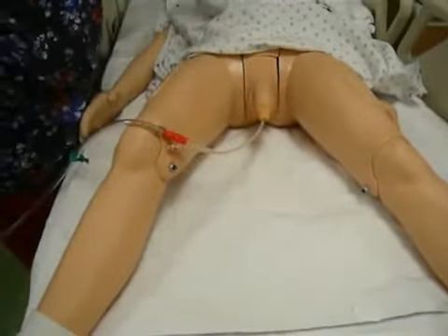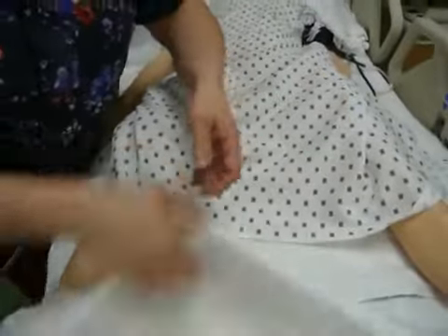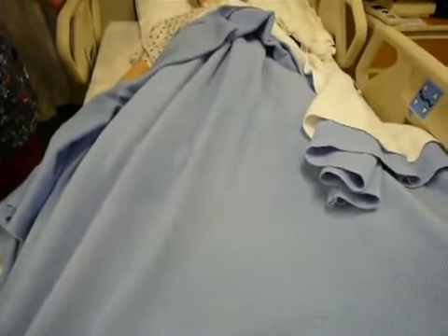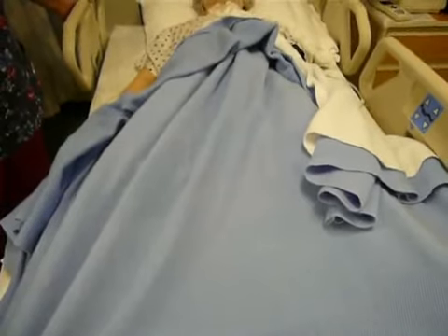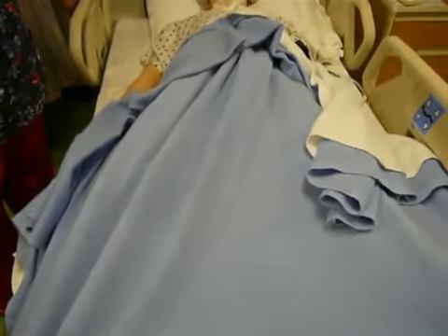And then I make sure that my patient is covered, and I put the bed down. Once I put the bed down, I may wash my hands, and then I'm going to document. And remember, I document the type of catheter I put in, the size of catheter, if I had any difficulties, and the amount of urine, the color of the urine, the quality of the urine, and that is male catheter insertion.